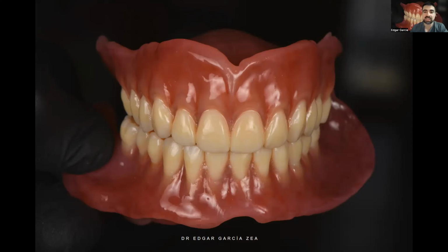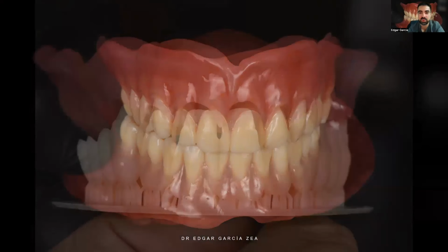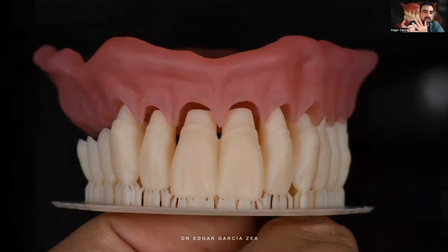Exactly. And if you want to go to another level, you can use materials like Nexco, if you have the ability to do this. You can create beautiful dentures using Nexco to do this characterization. But also, you see that I printed the teeth. You have an option to not do that, and to use stock teeth from Vita or Ivoclar. While you are designing the denture, they give you the exact space, so when you print this base, you only have to insert the teeth and bond them, right? Exactly.